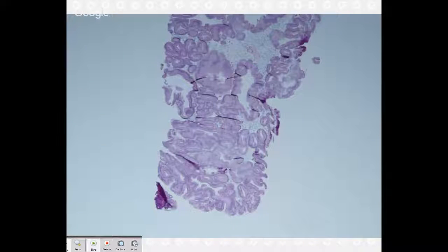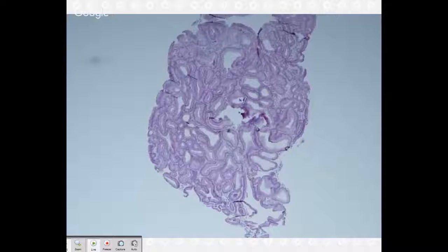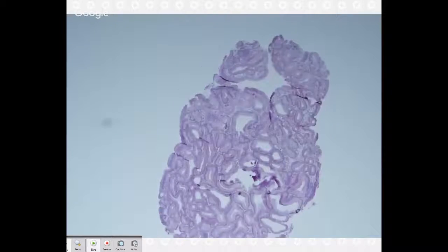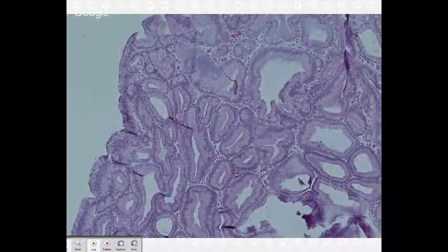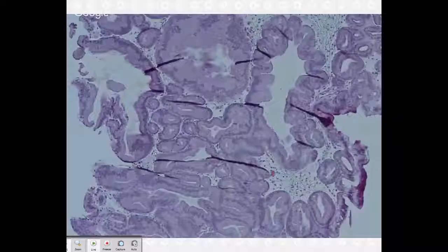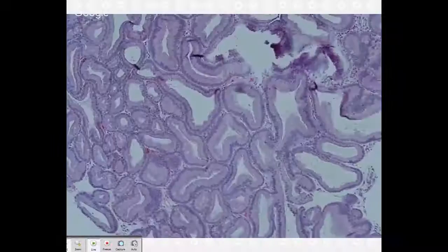Somebody that hasn't talked yet about a slide. I will point at you. All right, Mr. Green Shirt. What does this polyp look like to you? So it has varying size glands. Some of them are dilated. They look very complex and have penciled nuclei. Okay. So is this dysplastic? Well, keep going. Keep telling me what it looks like.